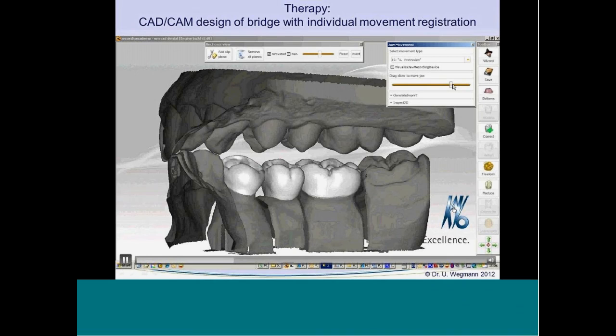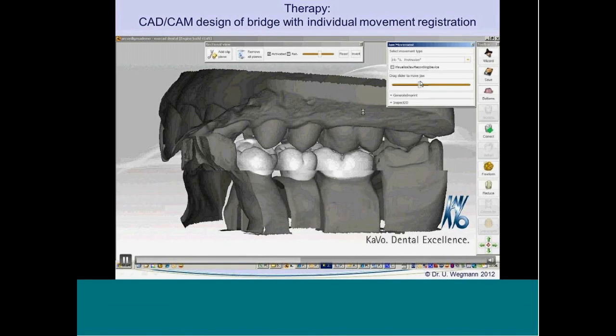And another example, you can do dynamic occlusion analysis. That means you can use this system also for better adjustment of the natural teeth.